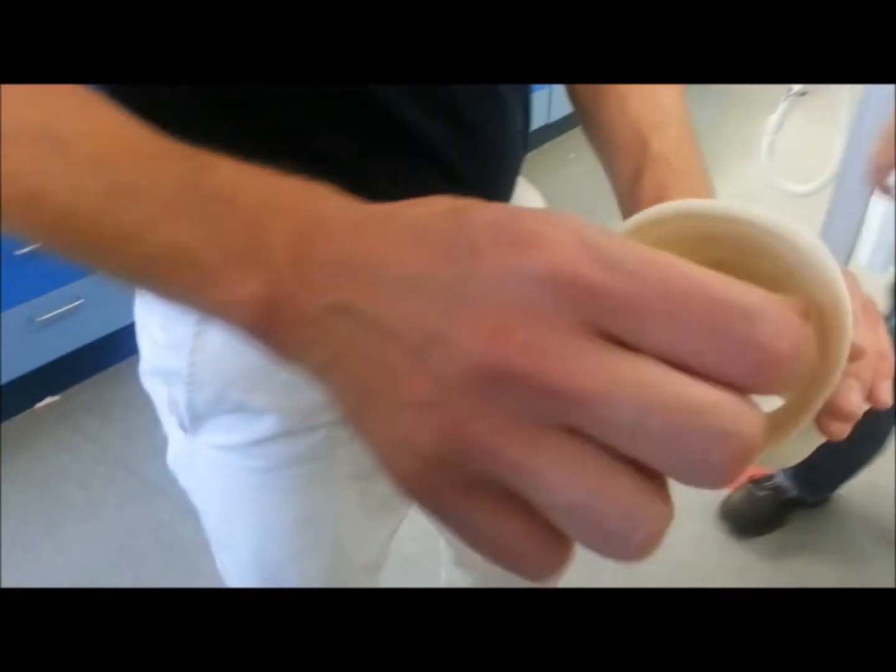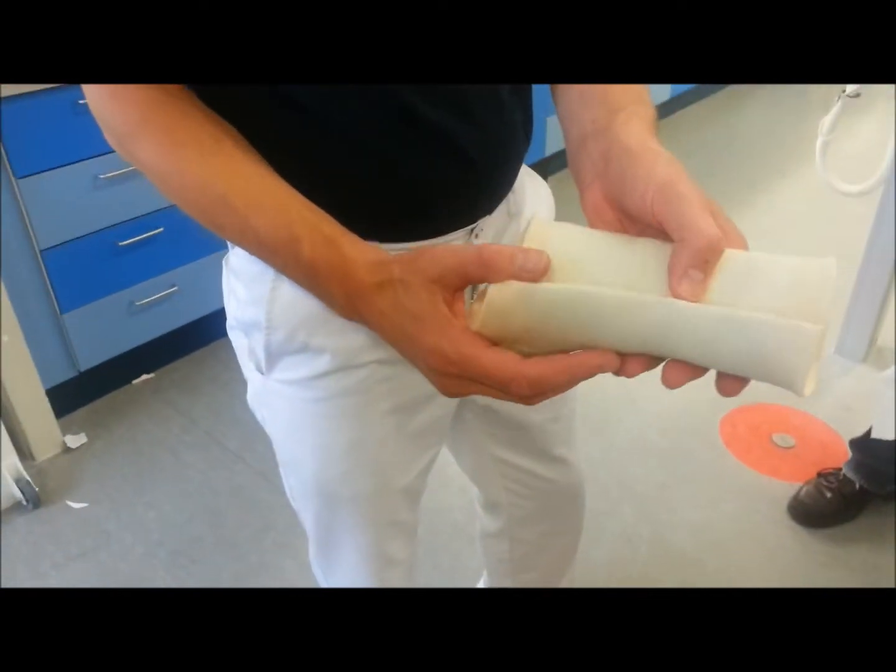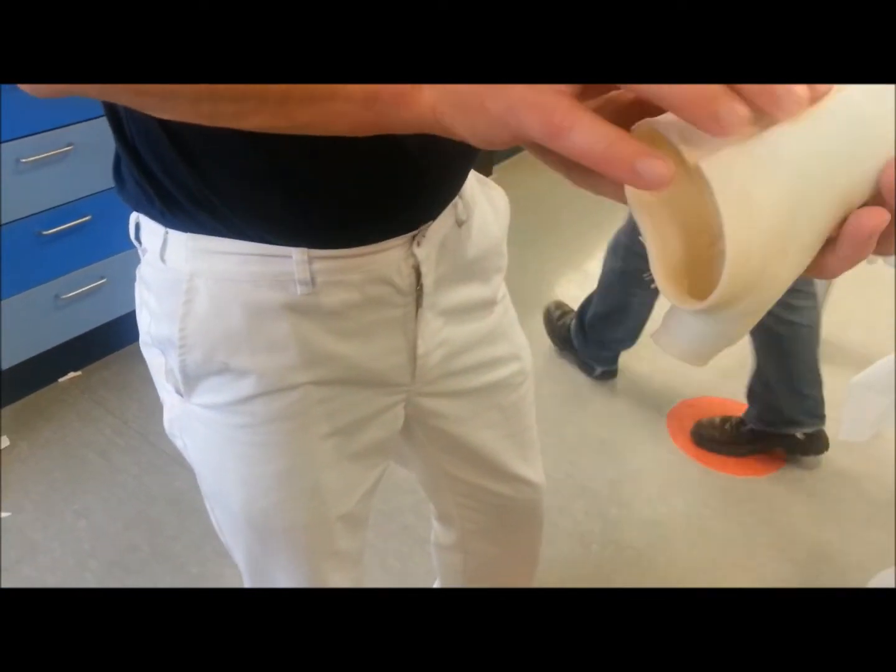This is still in the stockinette and you have to wait about 2-3 more minutes.